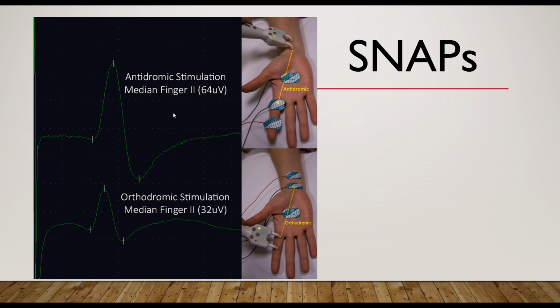Now, there's a difference in how we pick up these different responses in terms of the sizes and the cleanliness of the signals, whether you do it orthodromic or antidromic. If you do it in the antidromic direction, then on the whole one ends up having rather large responses.